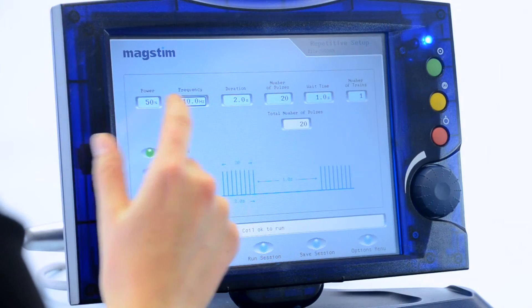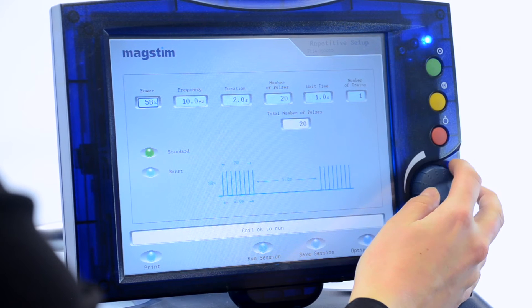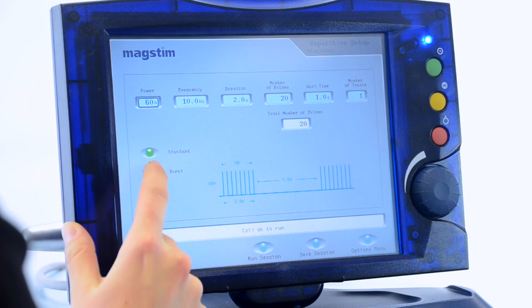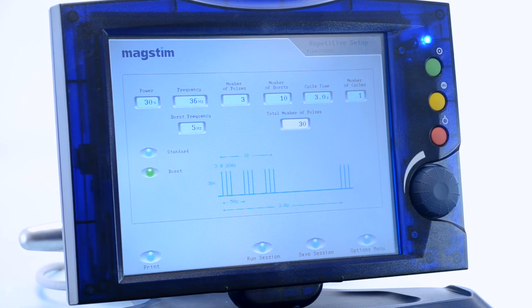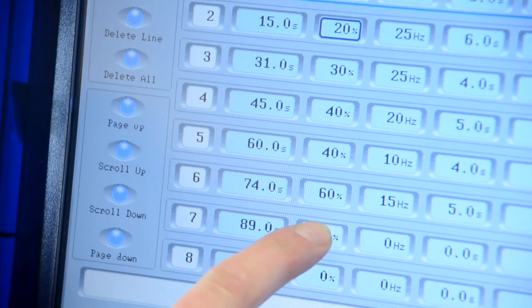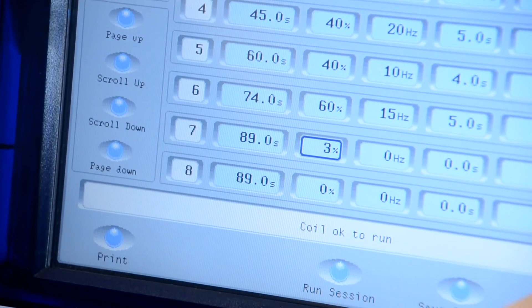In repetitive mode, you can set a continuous train of pulses with adjustable frequency and power, while burst mode allows for groups of pulses. In session mode, you can run different protocols sequentially, each with a different set of parameters.